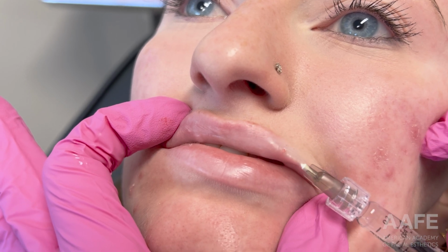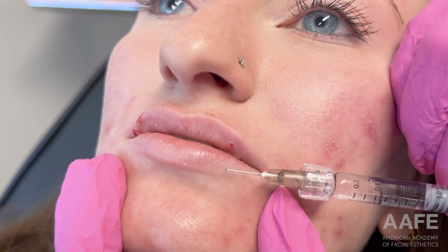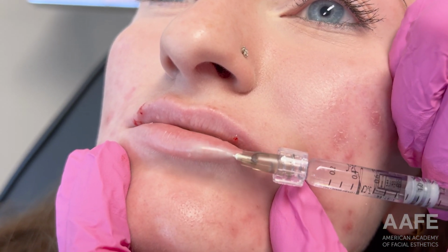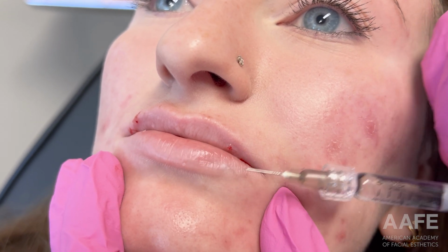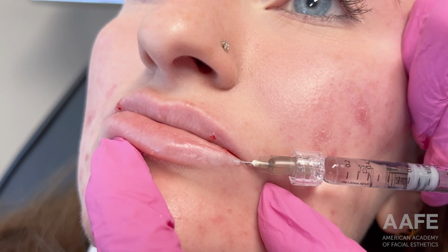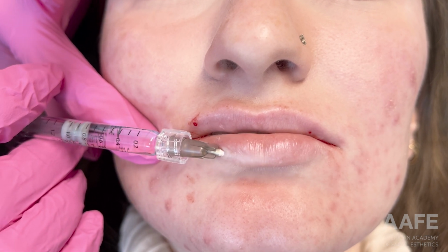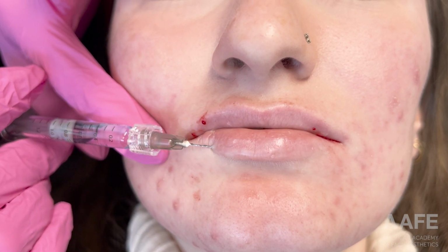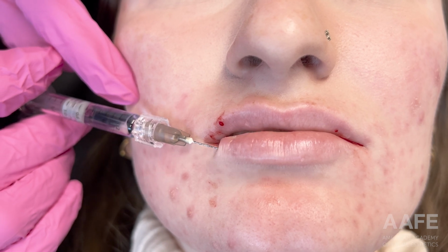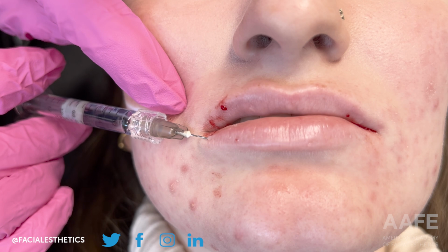You can see that I'm holding the lip taut, advancing my needle, and then laying some product. I'm retrograde injecting that product, so I'm moving out as I place the filler. She has been numbed topically, and the numbing agent that we use is very effective. You can see here she's flinching just a little bit. It is pinchy, but she's doing overall very well. I'm going from one side to the other, just really enhancing the already beautiful lips that she has and laying just a tiny bit of product.